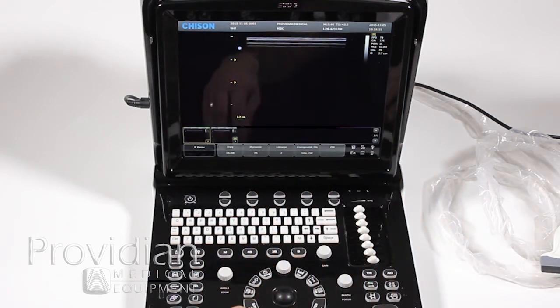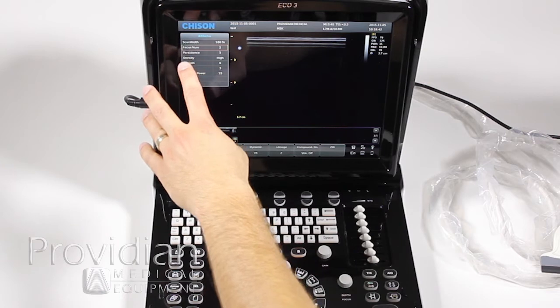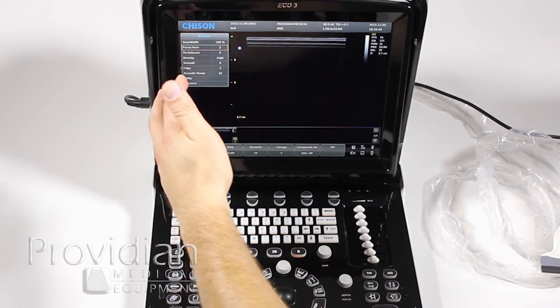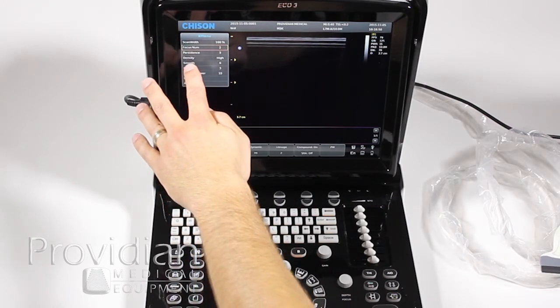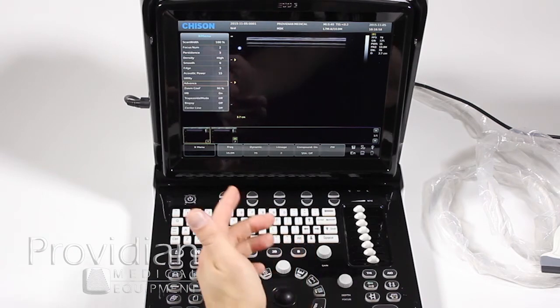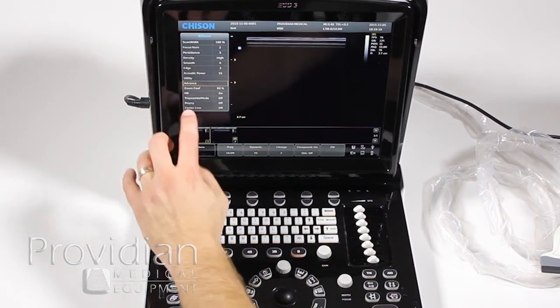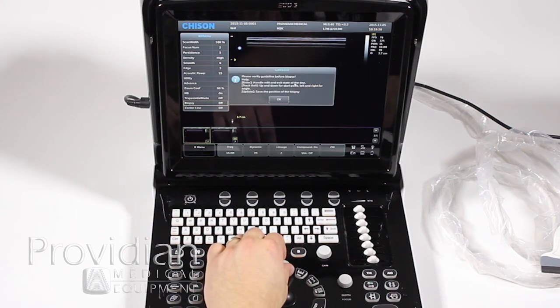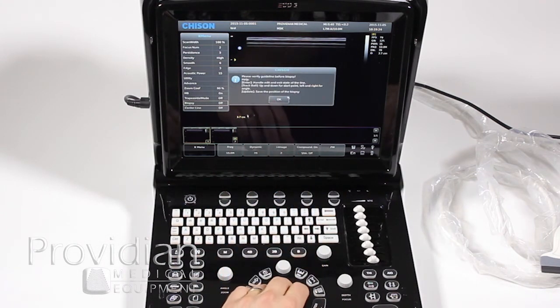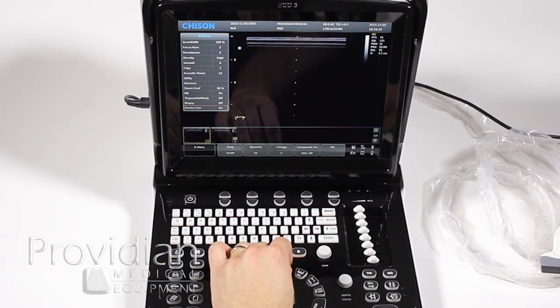We also have pulse wave Doppler over here. Pushing the menu button lets you adjust focal zones, scan width, persistence, and other settings that can increase frame rates or improve image quality. Persistence — also known as frame averaging — line density, smoothness, edge enhancement, and acoustic power are all accessible. Scrolling down to advanced options shows zoom coefficient and MB (multi-beam), which you'll want to leave on its default — it uses different technology than compound imaging to improve overall image resolution. You also have trapezoidal mode and biopsy, where you can flip on biopsy, confirm the needle position, and toggle the biopsy line and center line on and off.